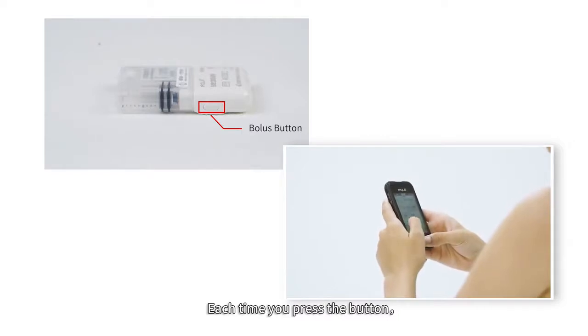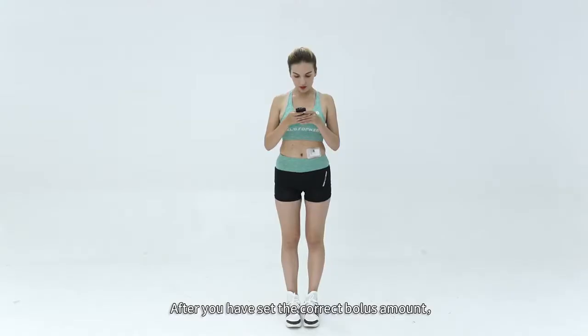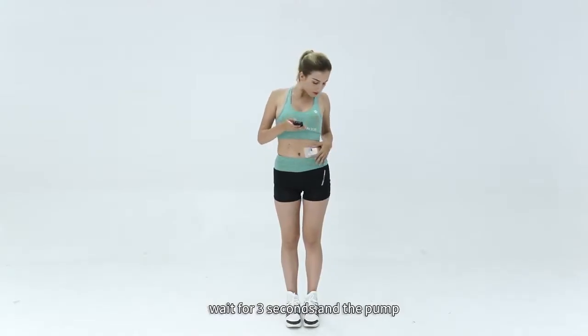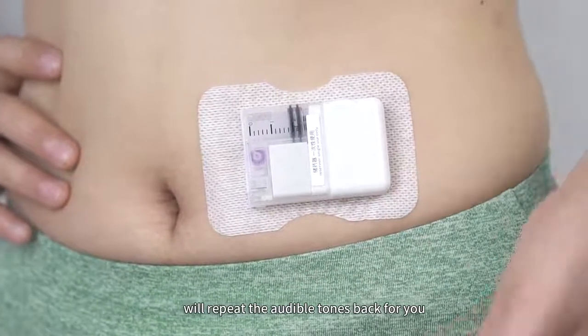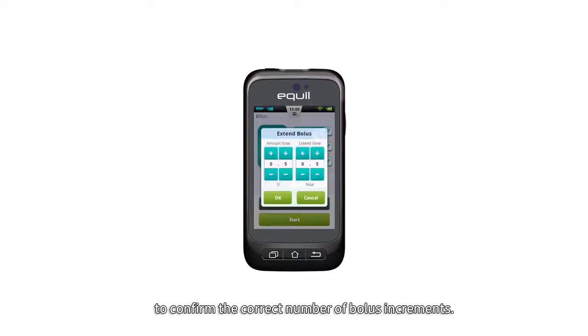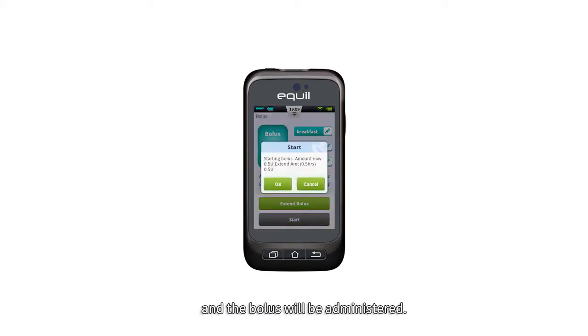Each time you press the button, the tone will ascend in pitch, up to 5. After you have set the correct bolus amount, wait for 3 seconds, and the pump will repeat the audible tones back to you to confirm the correct number of bolus increments. If the number of tones is correct, press the pump button one last time and the bolus will be administered.